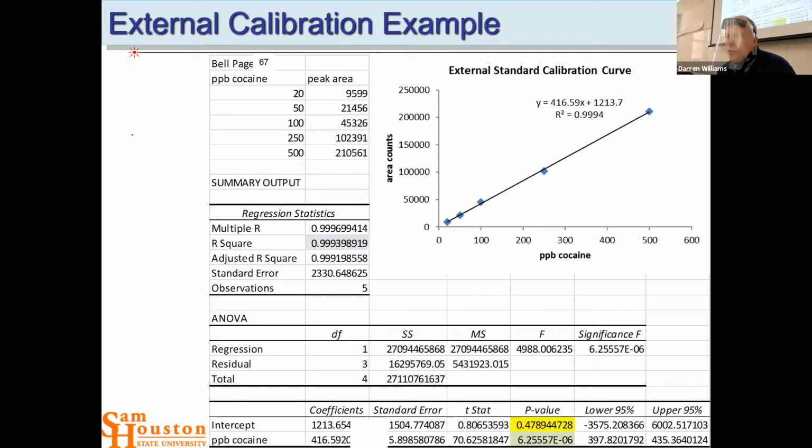So, on our chromatogram, we might have some other things that come out, and then we'll say, okay, this peak right here is cocaine. And so we would set our integration limits, and we would tell the software to run all of these samples in our sampling tray and pull the chromatograms and integrate between these 2 limits and report the data in a table.